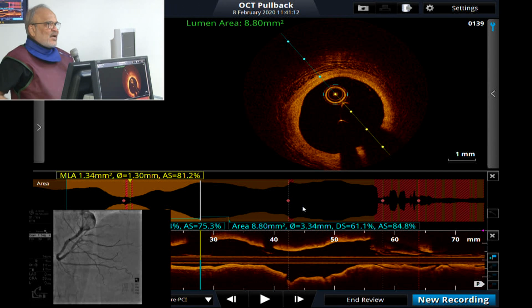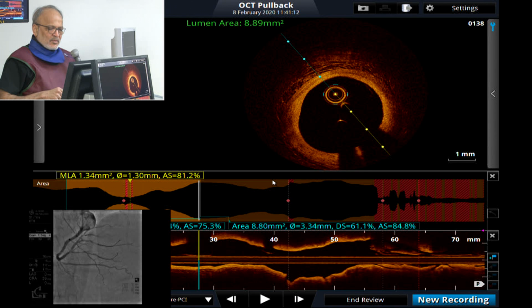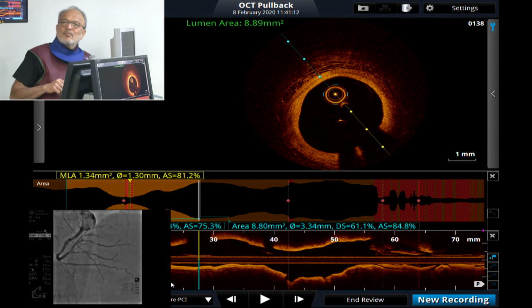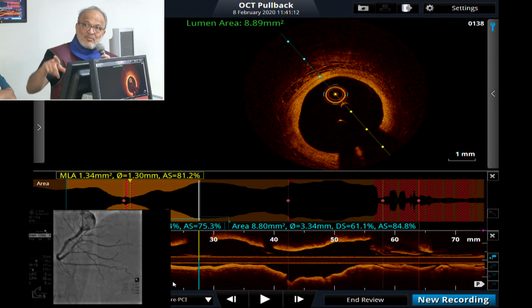One question. Now that you've seen such a lot of plaque burden at the origin of the side branch, do you think you would want to change your strategy, and instead of going for provisional stenting, go for a double stenting from the very beginning? No, I don't. I still think double stenting in a small artery is not a good idea. I also agree with Tak.